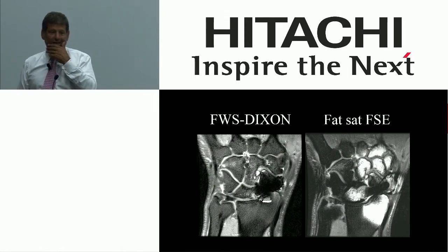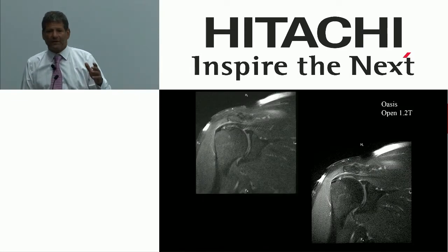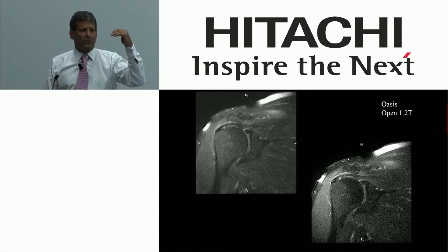Many, many facilities have adopted radial acquisitions, particularly for the shoulder. It's sort of the entry-level challenge. Everybody's got motion in the shoulder. If you can make these radial techniques work, it just makes you more reproducible.